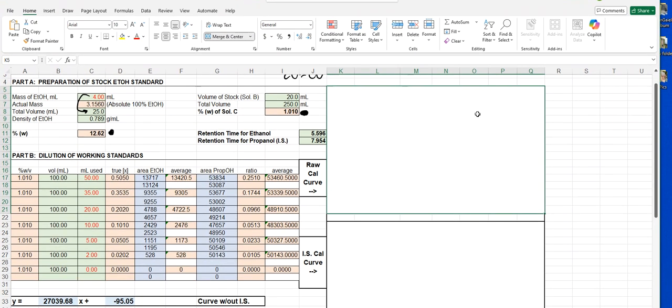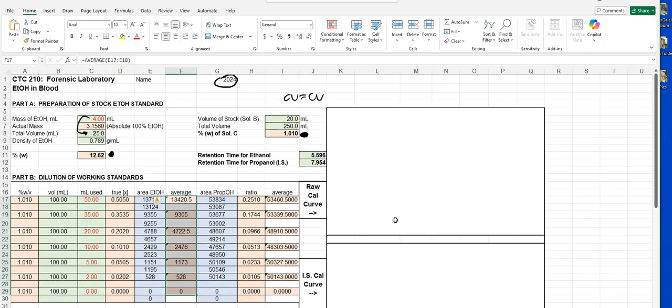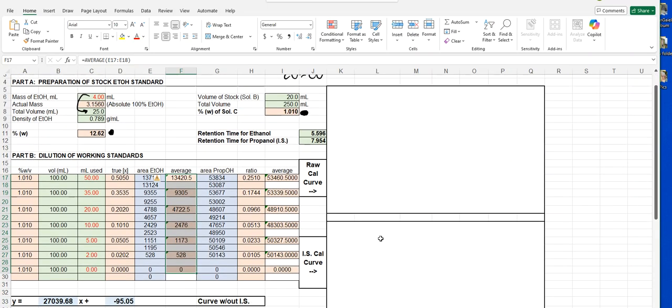All right, folks, so we are coming back in this lecture video and we're talking about how to generate a calibration curve based on the laboratory data that we obtained. But the problem here is that the lab data is not actually together one after another, nor is it side by side. There's like a weird little column in here that makes it odd and in a strange place. We can do calibration curves though the exact same way. We just got to know how to handle these.